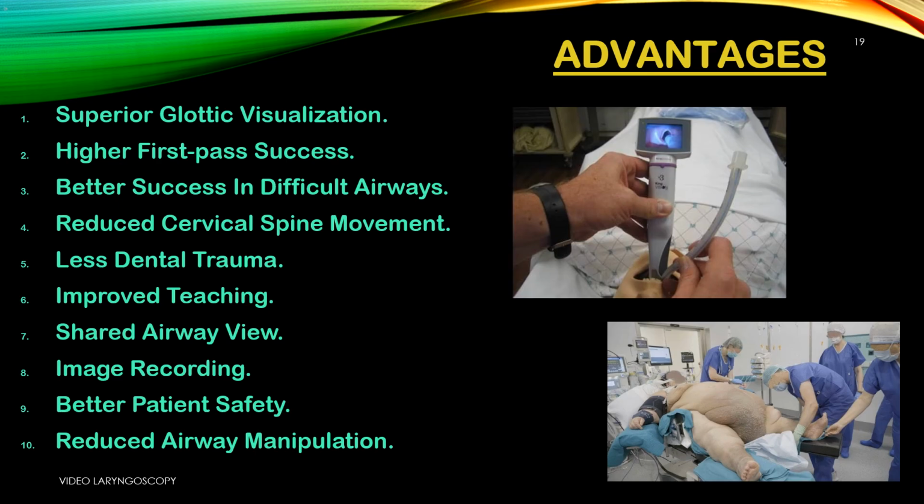2. Higher first pass success. More likely to get the tube in on the first try. Reduces time without oxygen. 3. Better success in difficult airways. Works well with swelling, obesity, or limited mouth opening where direct laryngoscopy fails.